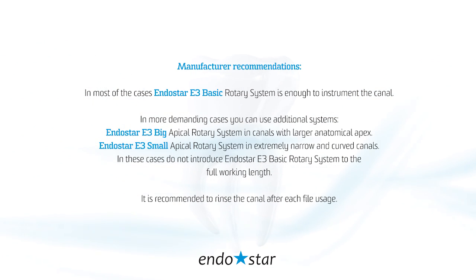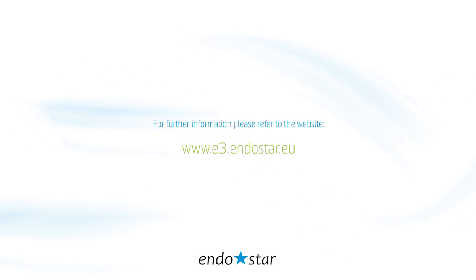In most cases, the EndoStar E3 basic rotary system is enough to instrument the canal. In more demanding cases, you can use additional systems: the EndoStar E3 big apical rotary system in canals with larger anatomical apex, and the EndoStar E3 small apical rotary system in extremely narrow and curved canals. In these cases, do not introduce the EndoStar E3 basic rotary system to the full working length. It is recommended to rinse the canal after each file usage. For further information, please refer to the website www.endostar.eu.